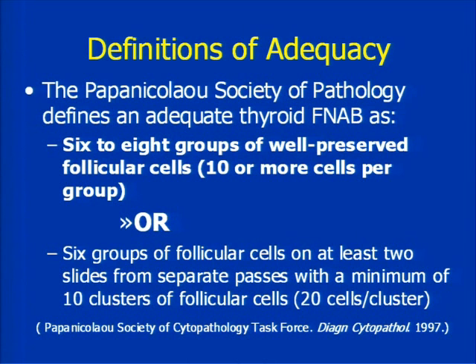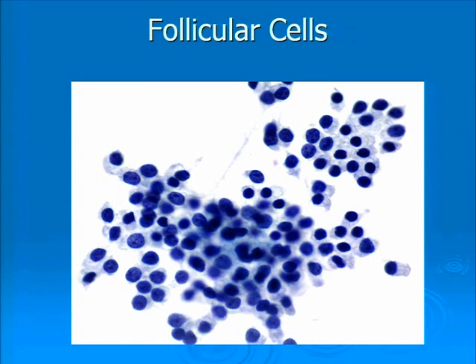So what do we look for? You're going to look at some of this across the hall. Follicular cells typically have nice round nuclei. In benign nodules, they really don't overlap a whole lot. The cytoplasm is nice and thin and lacy, and they're very respectful of each other.